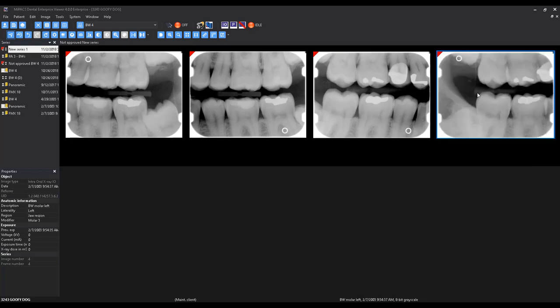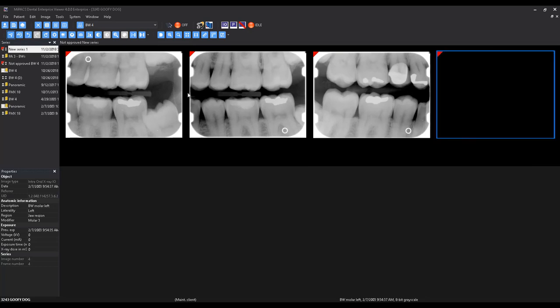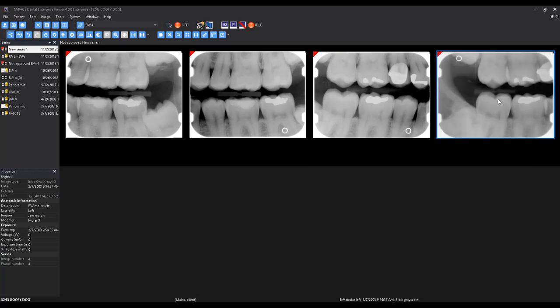You can also rearrange the images and adjust the brightness and contrast if necessary.